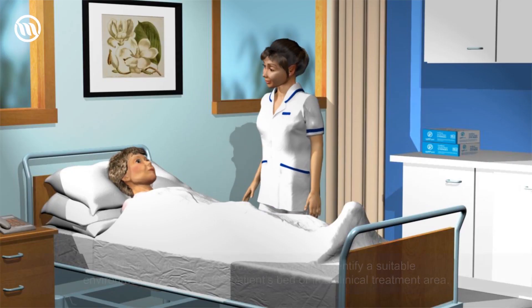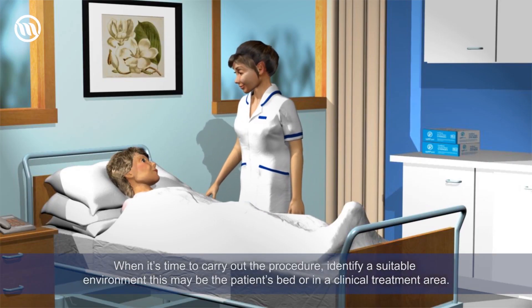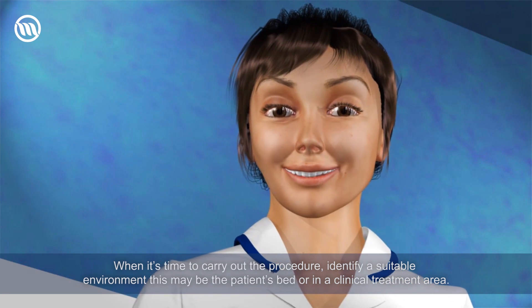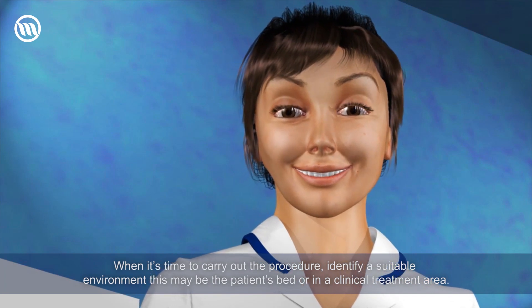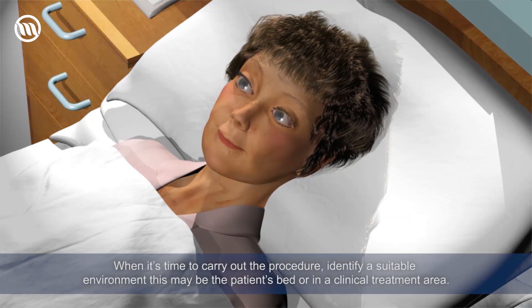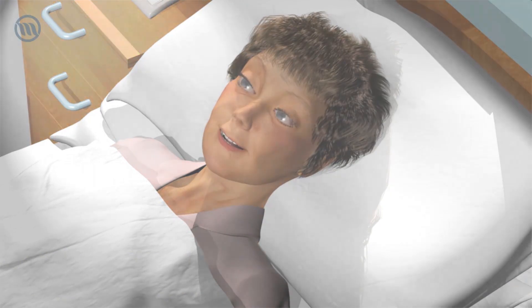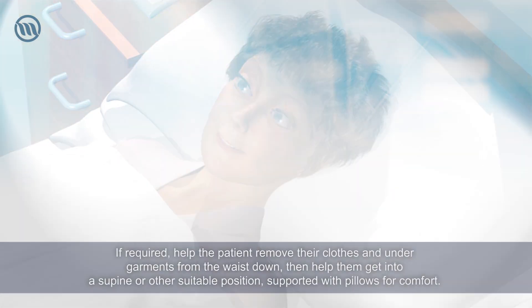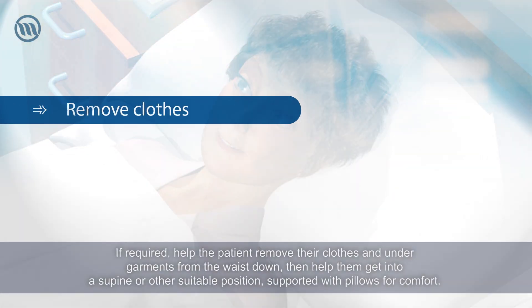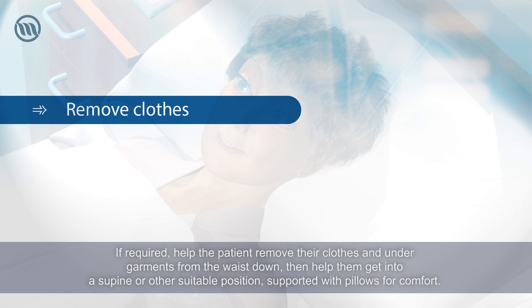When it's time to carry out the procedure, identify a suitable environment. This may be the patient's bed or in a clinical treatment area. If required, help the patient remove their clothes and undergarments from the waist down.